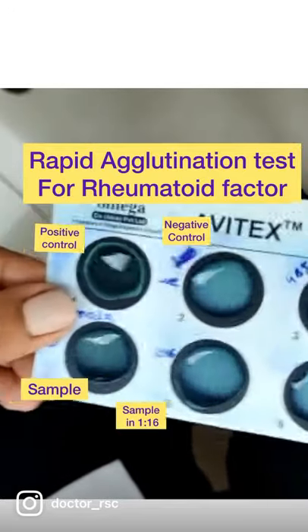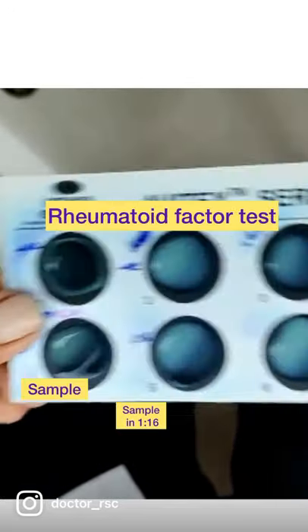Agglutination test for rheumatoid factor. Here we see the positive control showing very good agglutination.